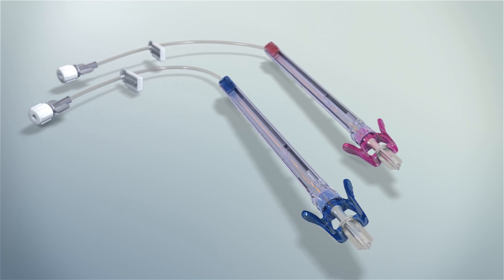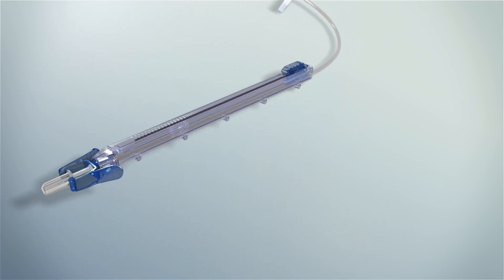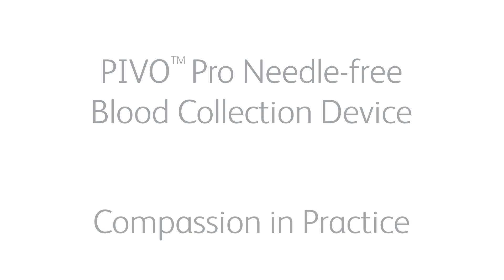High quality blood collection from indwelling peripheral IV catheters is now possible, helping to create a better patient experience. PIVO Pro Needle-Free Blood Collection is compassion in practice.